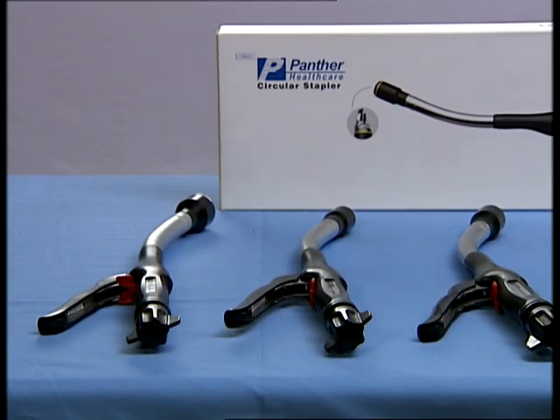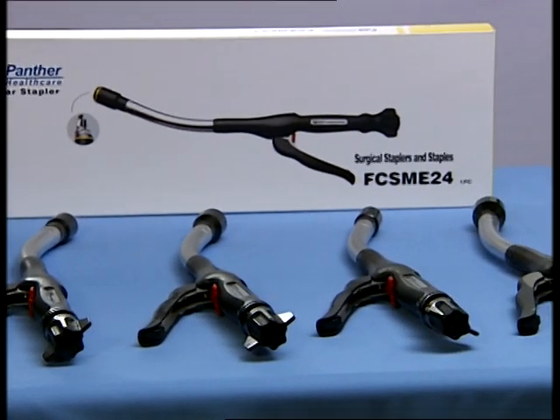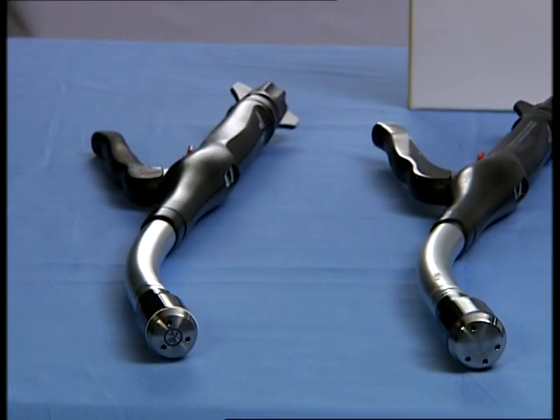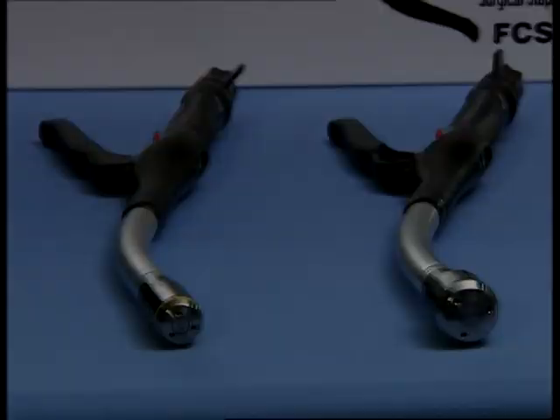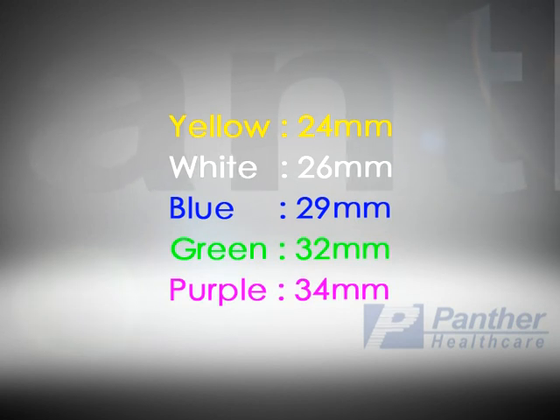Panther's circular staplers are single-use instruments and are available in five sizes to permit proper matching of instrument to diameter of the lumen. The packaging and the detachable anvil heads are color-coded for easy size recognition: yellow is 24 mm, white is 26 mm, blue is 29 mm, green is 32 mm, and purple is 34 mm.